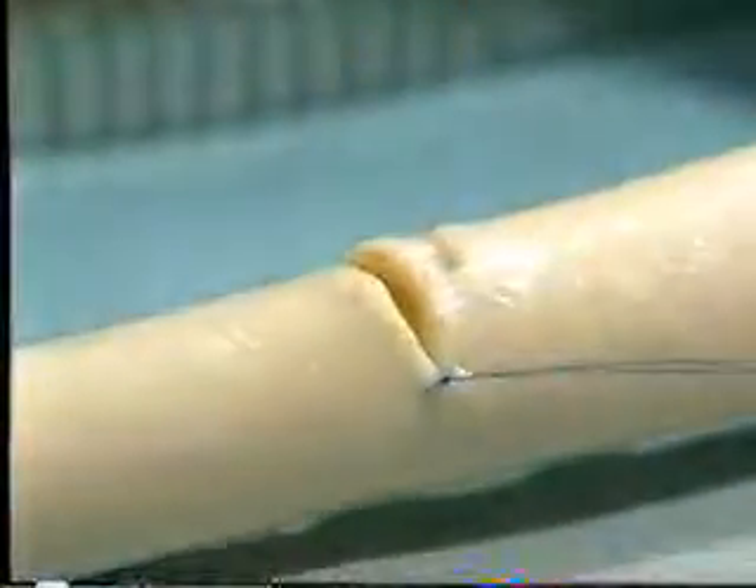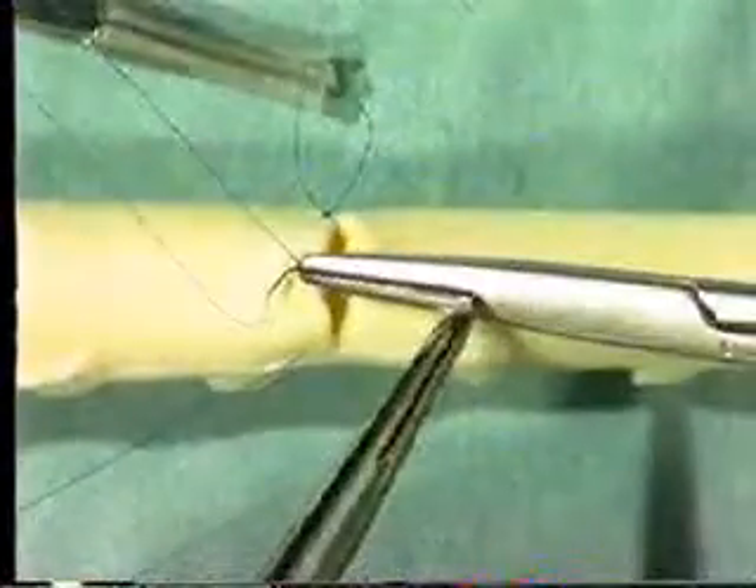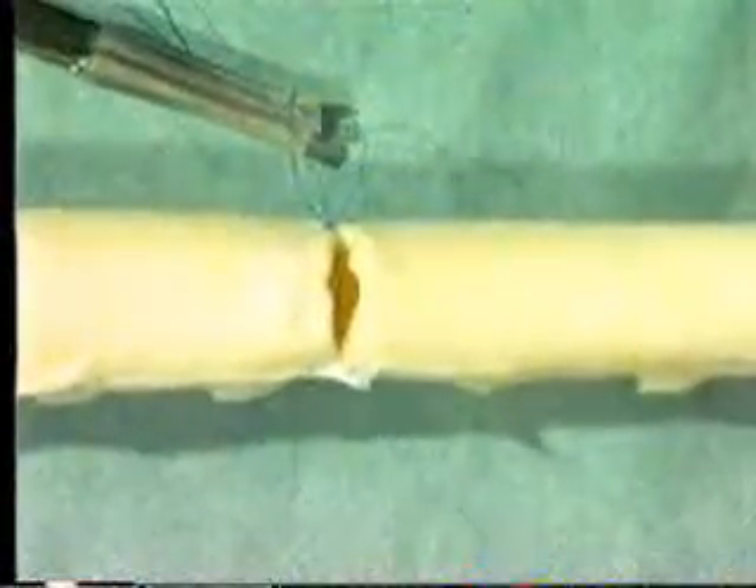Tie the suture and ensure that each throw of the knot is laid as a proper reef knot, remembering that several throws are required. Then secure it in a rubber shod hemostat. Take a new suture and insert it in a similar manner at the opposite end of the incision, once again going from inside to outside with both needles. Then ligate it using a formal reef knot technique and place one end in a rubber shod hemostat.